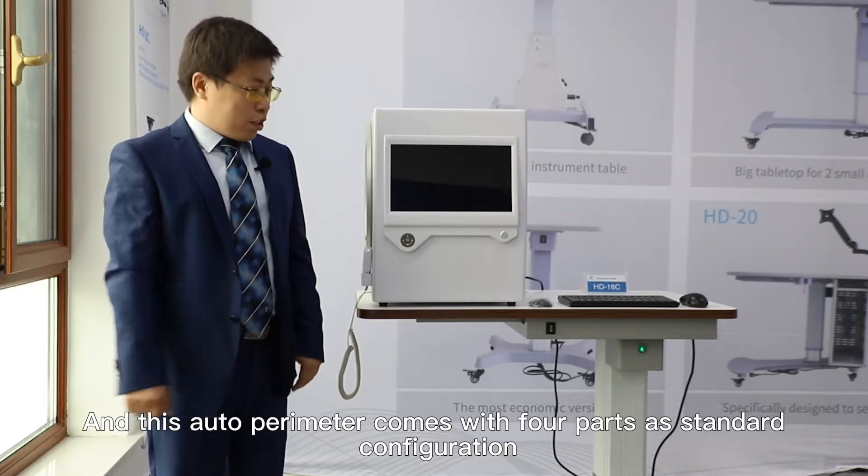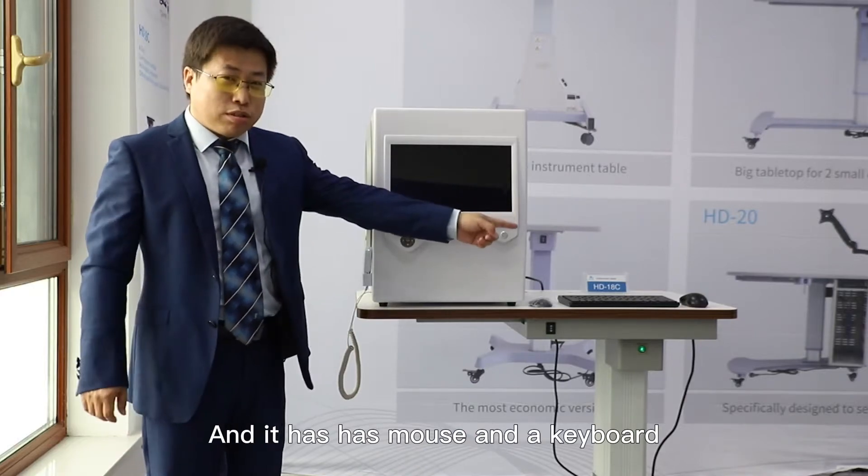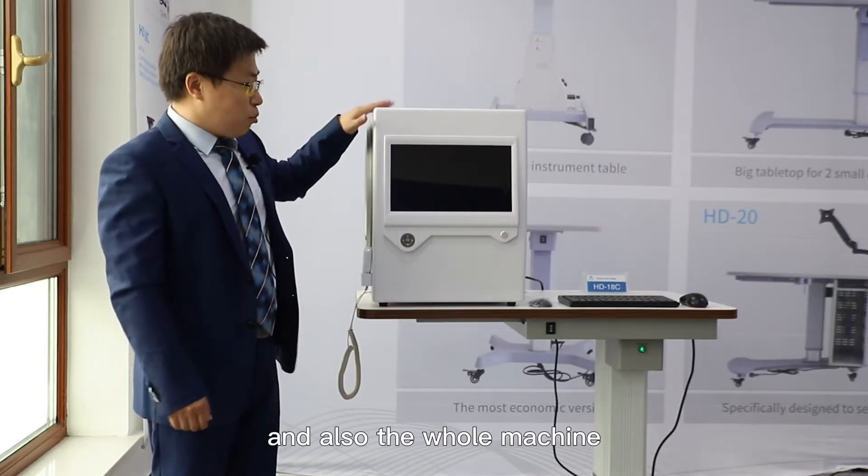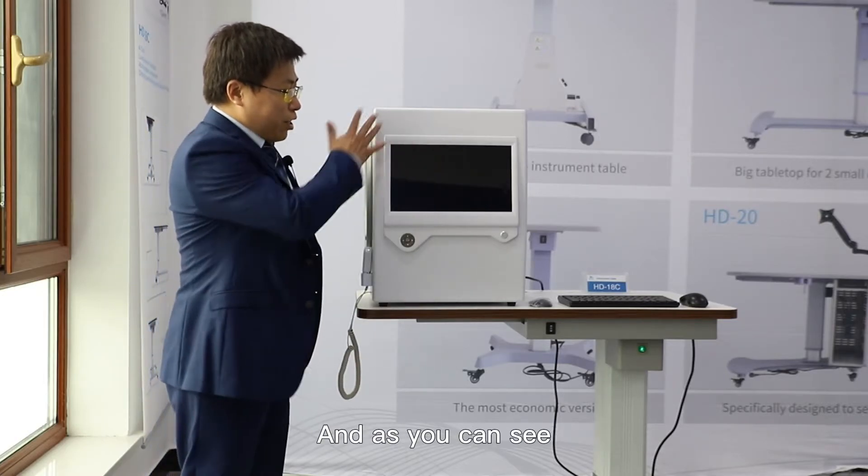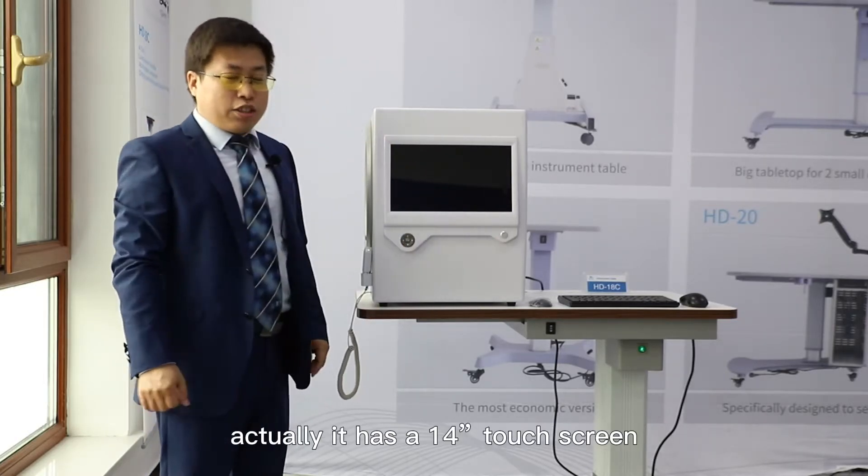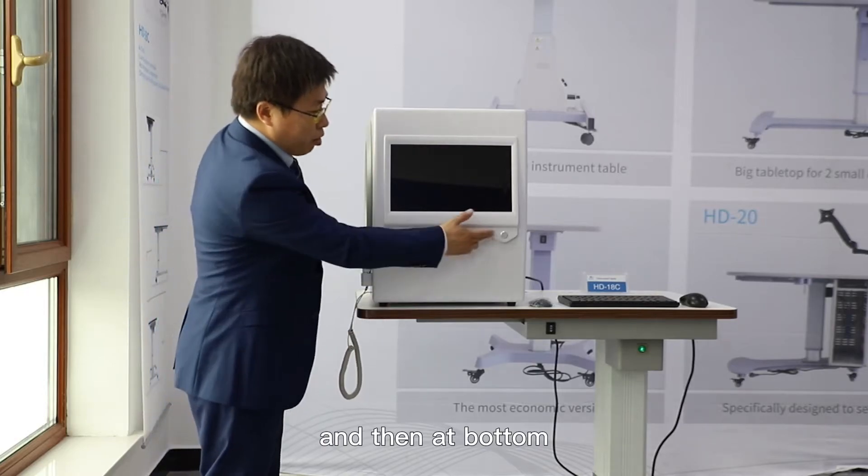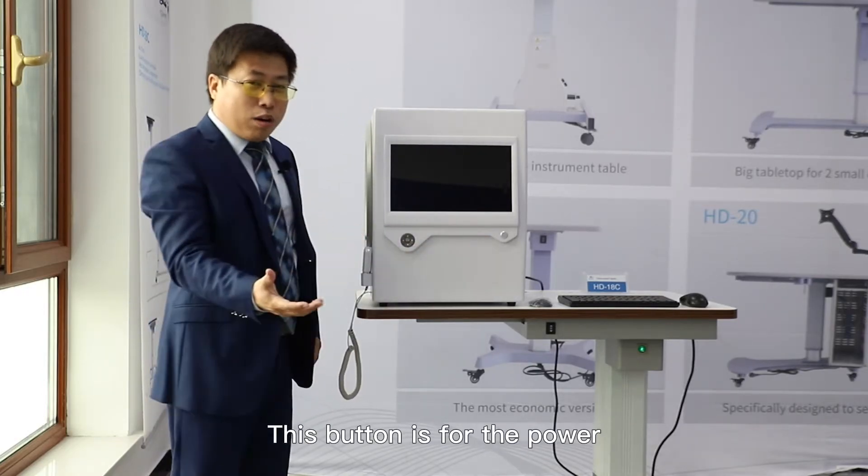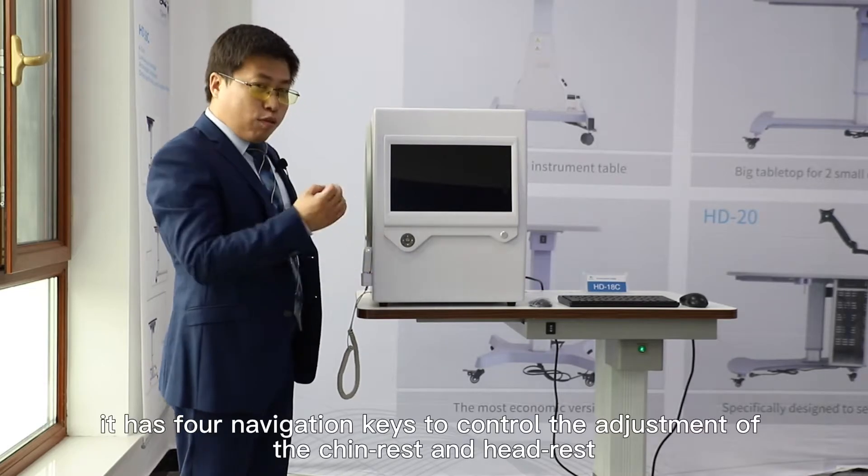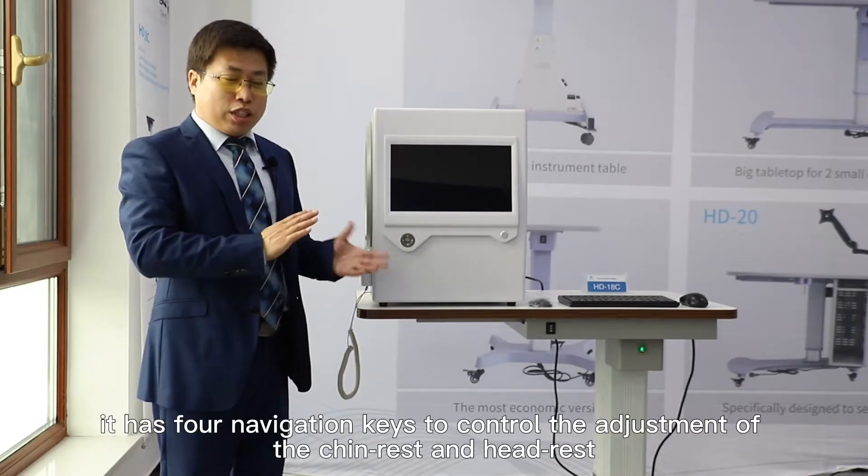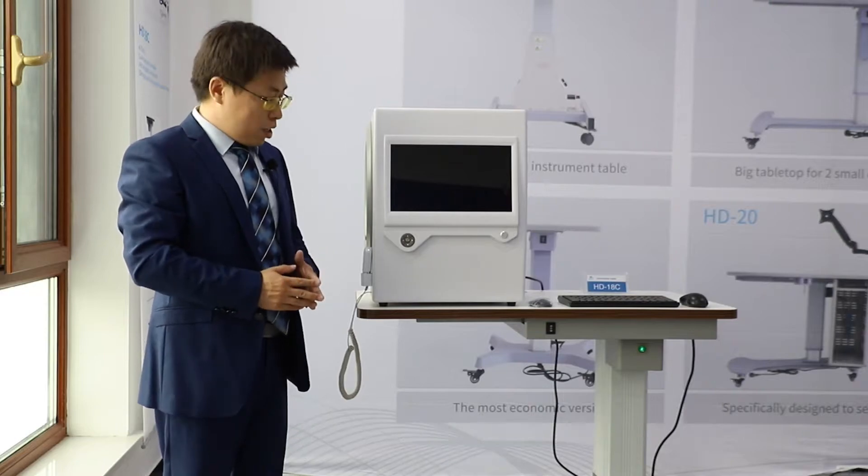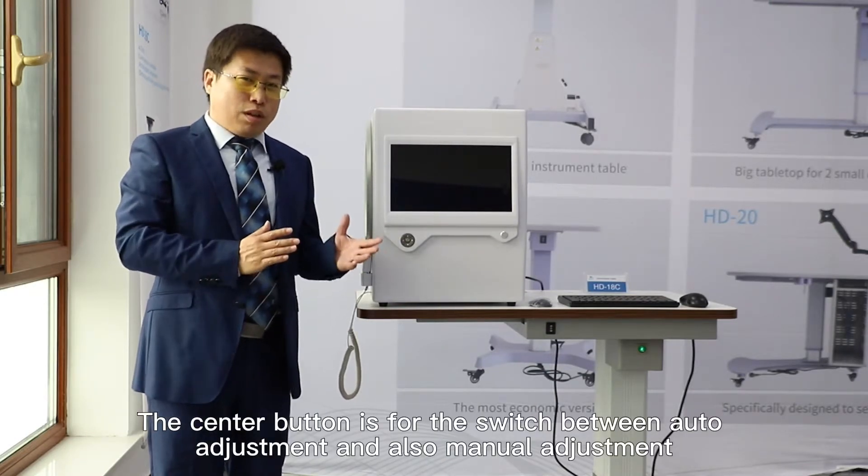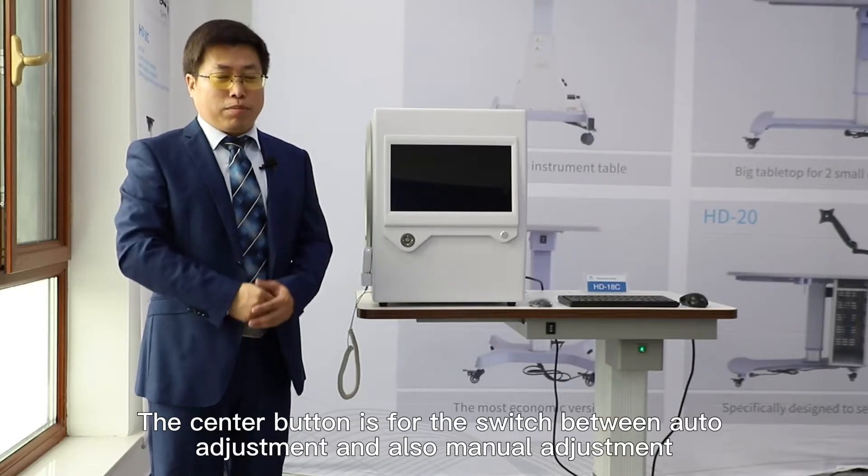It has a mouse and keyboard, patch, and the whole machine. As you can see, it has a 14-inch touch screen. At the bottom there are two buttons: this button is for power, and this button has four navigation keys to control the adjustment of the chinrest and headrest. The center button is for switching between auto adjustment and manual adjustment.